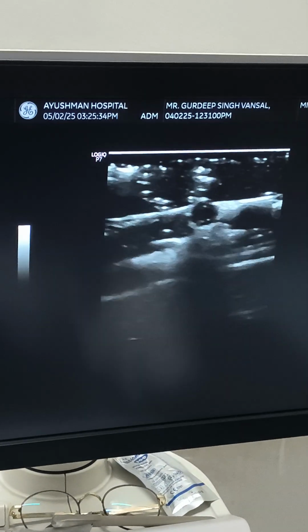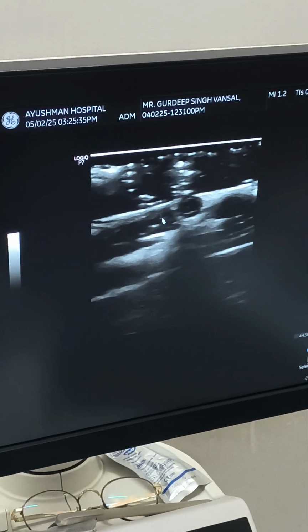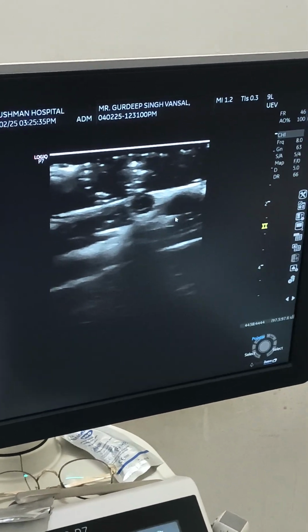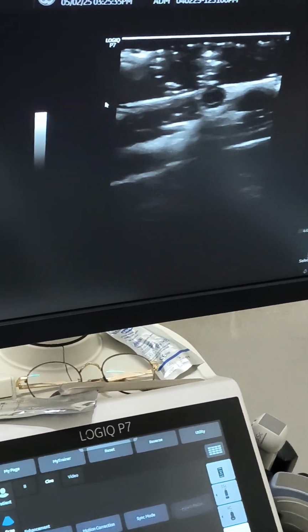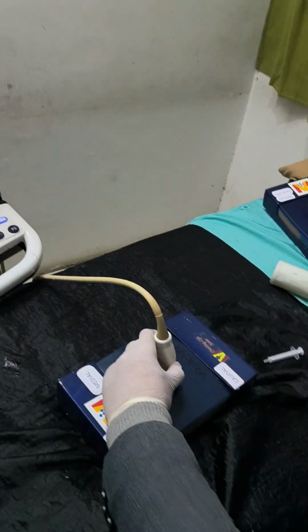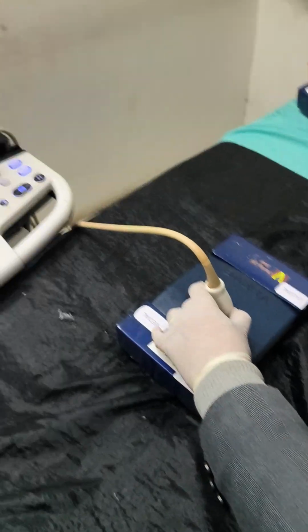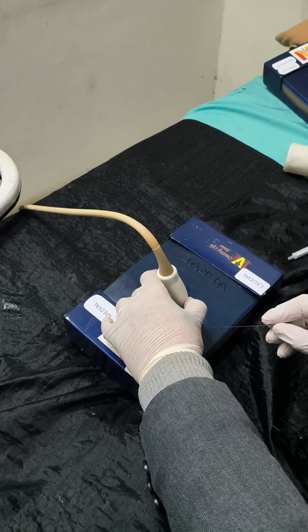Now, for practice, you can ask the candidate to come here, you can ask the candidate to come here also, down there. So you can put the target over here for longer needle trajectory, and here also for steep angle. So this is what you can practice. You can assume, that's what I was saying, any target to be hit. So now see, I have to come at the lower end of the vessel. This is our vessel. Okay, so my angle will be approximately, most of the time it is 45.